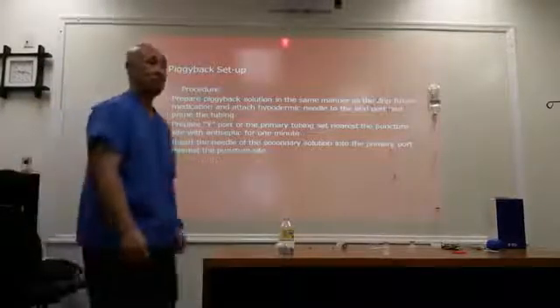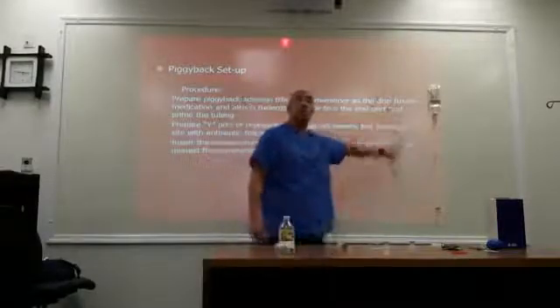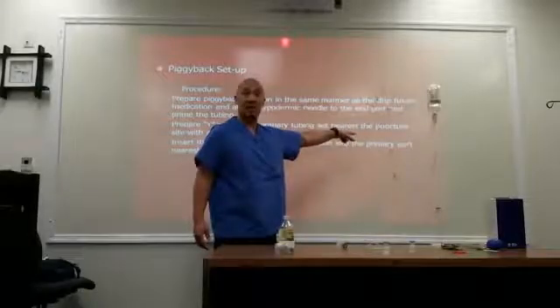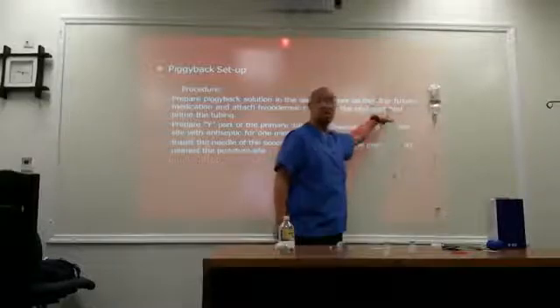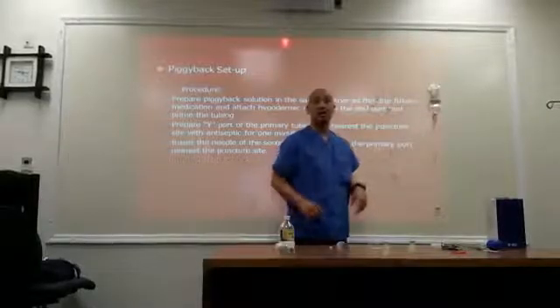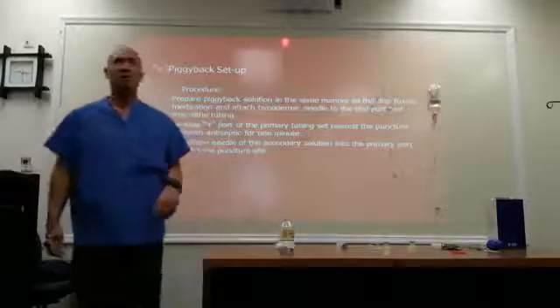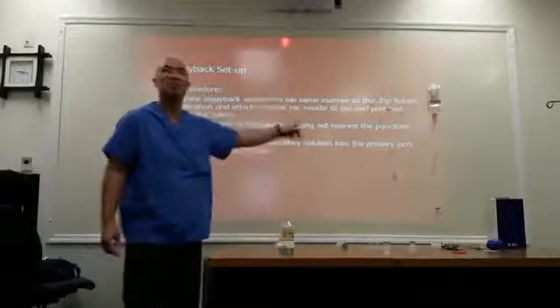The piggyback. All it is, I'm not starting a line here. Patient is already coming down with an IV line. They may be coming down with some kind of medication already going in through their IV line. You've got an existing IV line. Do I need to start one up? No, there's already one in there. Why should I start one up? I'm going to use the existing one.